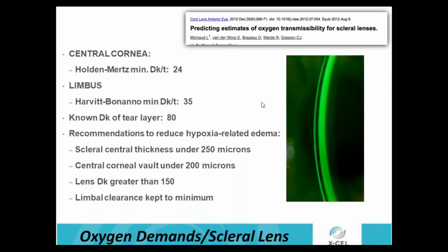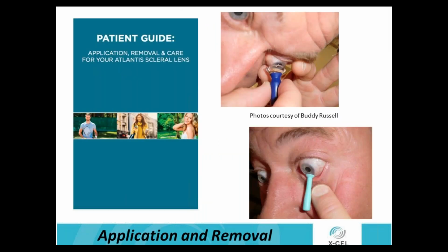And a lot of what we're going to do in this troubleshooting is how you have to know what you're dealing with, with the patients. Do watch them going through the cleaning regimen. Watching them handling the lens can also help with choosing a material or troubleshooting some other problems.